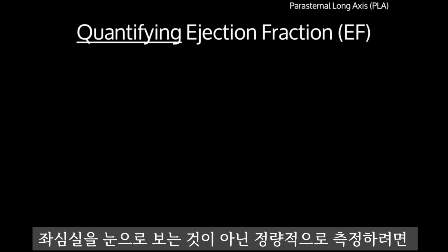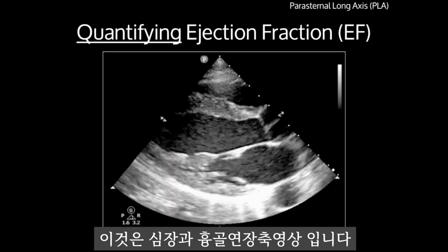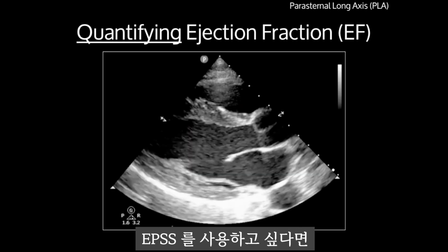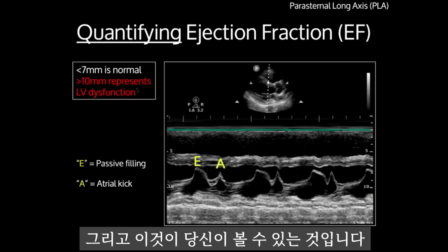If you want to quantitatively measure the ejection fraction and not exactly eyeball it, you can do so using EPSS, or E-point septal separation. This is a heart in the parasternal long axis view. If we want to use EPSS, we just throw down an M-mode spike at the tip of the anterior mitral valve leaflet, and this is what you will see.